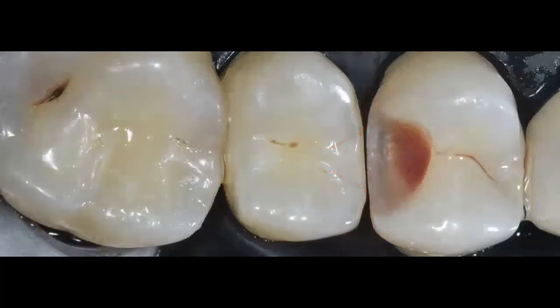So now with the wedge in place, you have seen that I have been able to not only open or widen buccolingually my boxes a little bit more, but I've also been able to bevel the enamel on the lingual and the buccal wall of my box, and also on the gingival floor. So again, just beveling that using a very fine diamond burr, keeping that wedge in place while you're beveling, allows you to obtain a final preparation that looks a lot like what you're seeing on this photo, which is ideal for bonding, and we all know that.